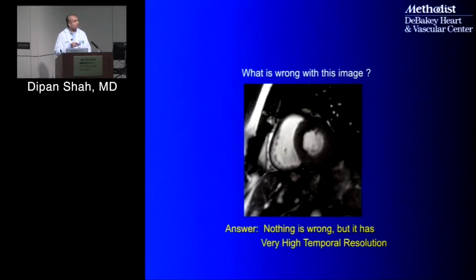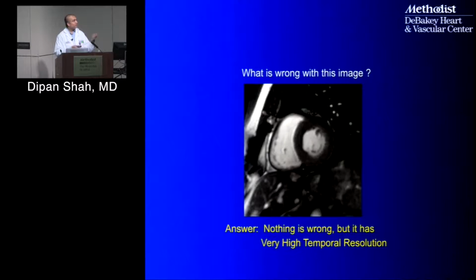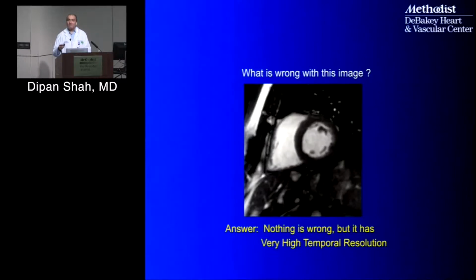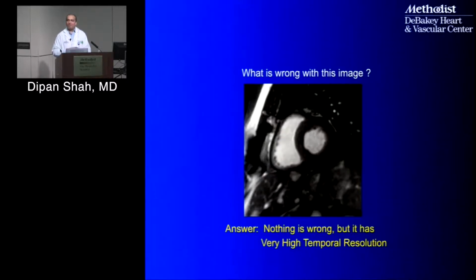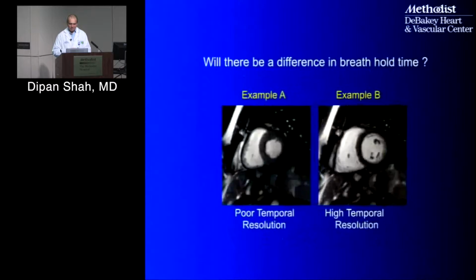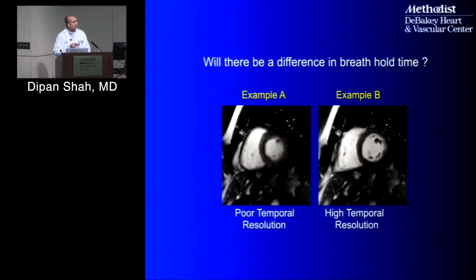Now the cost here, though, is that the breath hold time is much longer. So this was a 30-second breath hold. So this is one of our techs who's young and healthy who could do this, no problem. But the average patient is not going to be able to do that. So the ideal resolution is whatever is optimal for any given patient as far as how long they can hold their breath for. This is a case where the resolution is too poor. It's 80 milliseconds. This is a case where it's 10 milliseconds per frame. The ideal is somewhere in between.